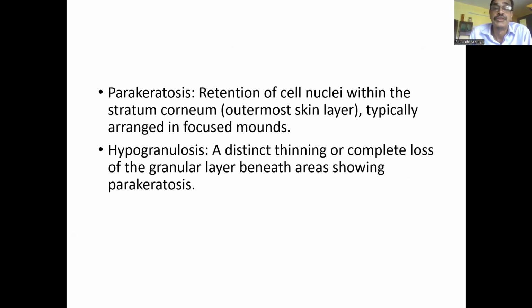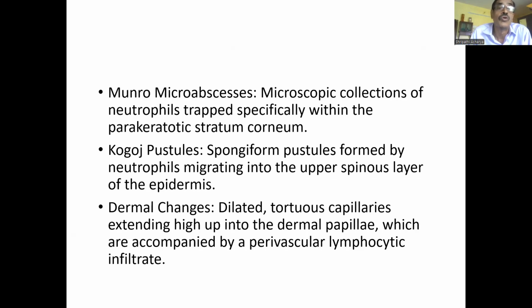Hypogranulosis, a distinct thinning or complete loss of the granular layer beneath areas showing parakeratosis. Munro microabscesses, microscopic collections of neutrophils trapped specifically within the parakeratotic stratum corneum.